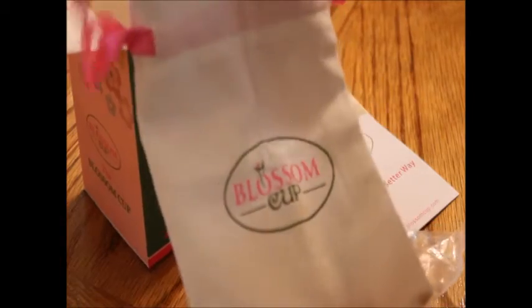It also comes with this cute little bag to keep it in. You can just throw this in your purse and no one will ever know what it is.